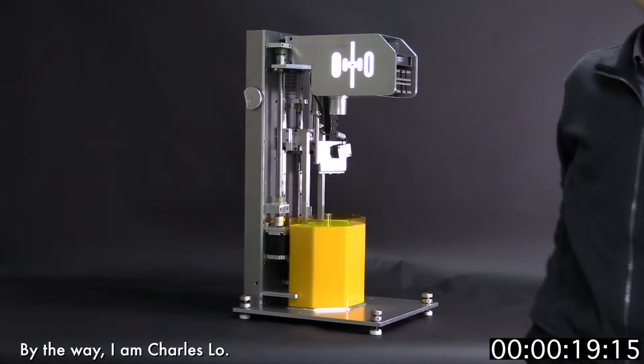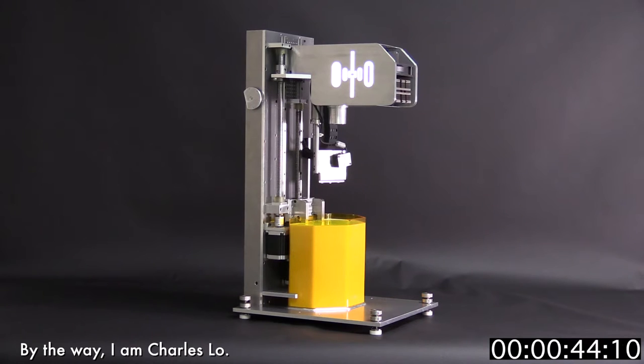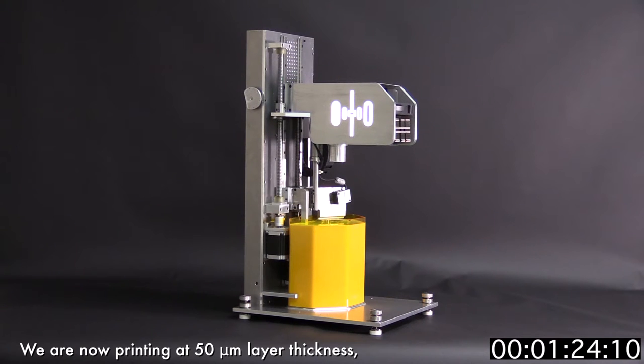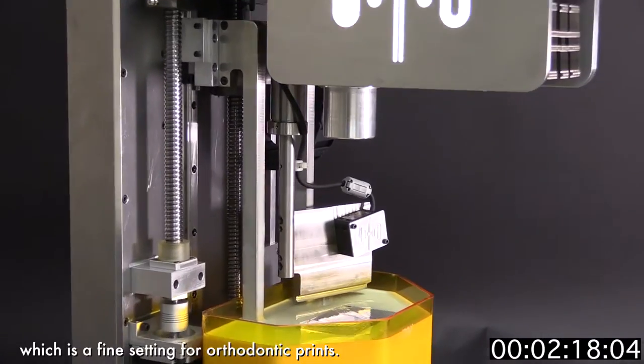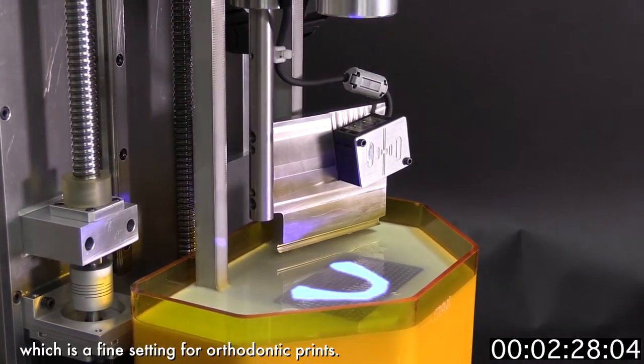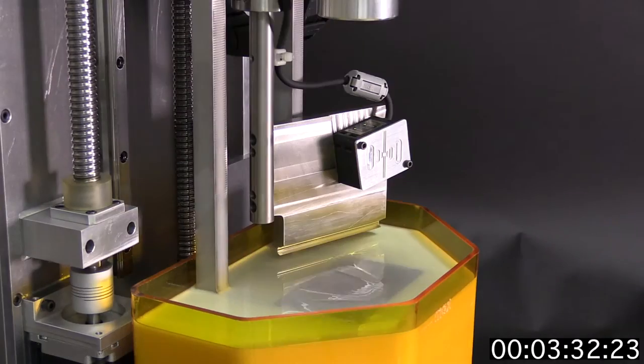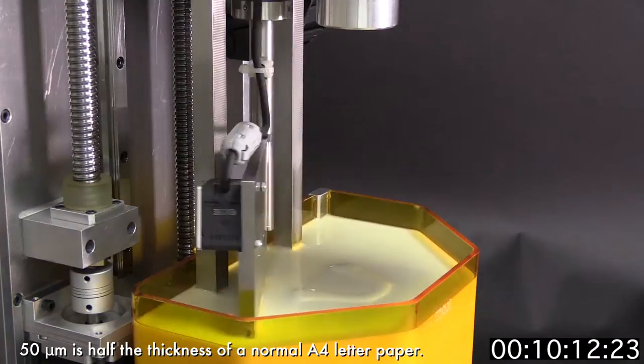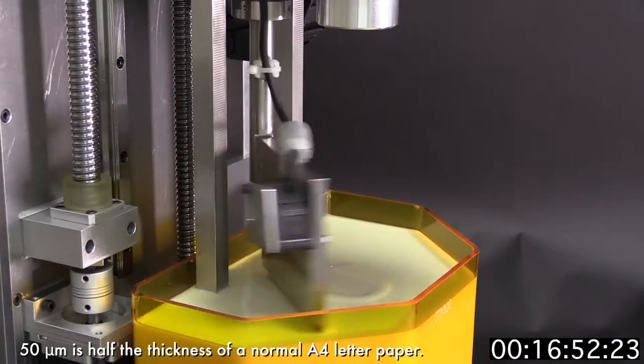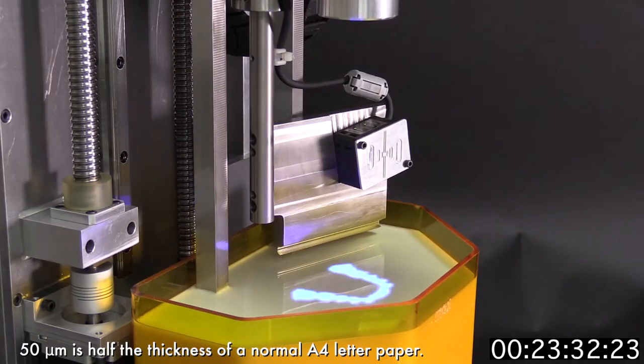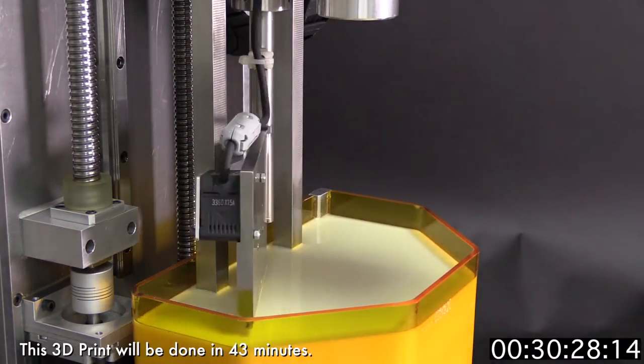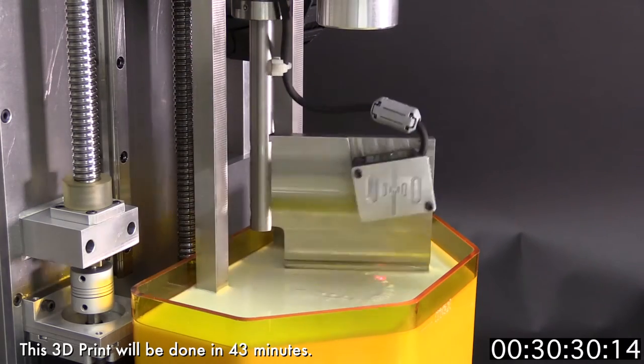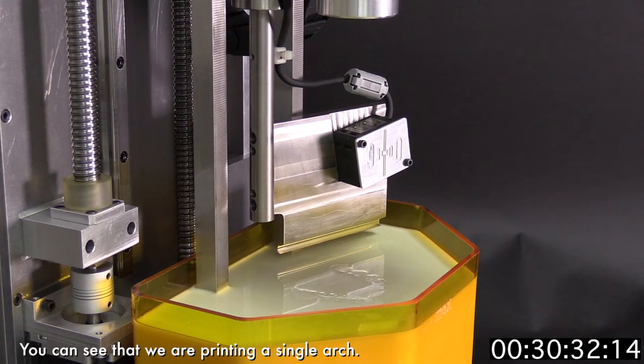By the way, I'm Charles Lo. We are now printing at 50 micrometer layer thickness, which is the fine setting for orthodontic prints. 50 micrometer is half the thickness of a normal A4 letter paper. We are doing high-speed printing here. This 3D print will be done in 43 minutes. You can see that we are printing a single arch.